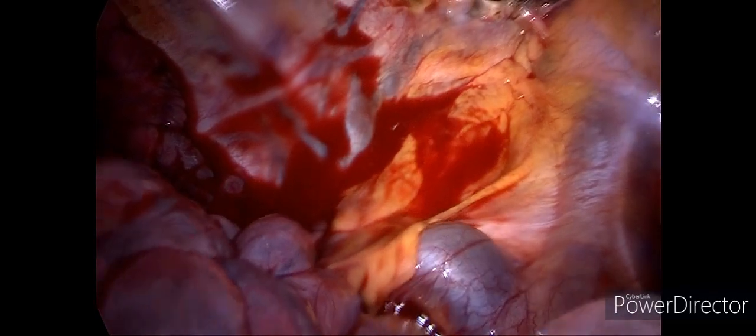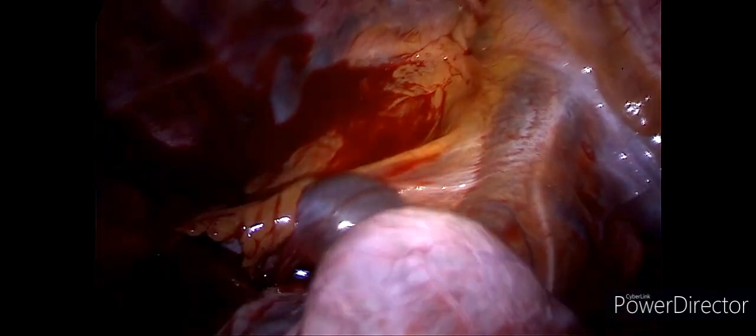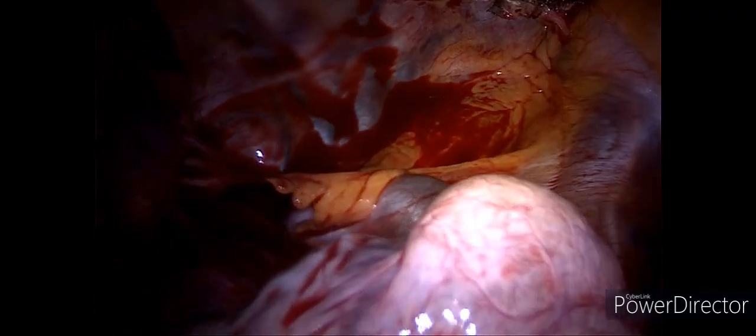And at the end, we felt some resistance posteriorly, and there was this last band that needed to be taken down so we can mobilize the whole upper lobe.